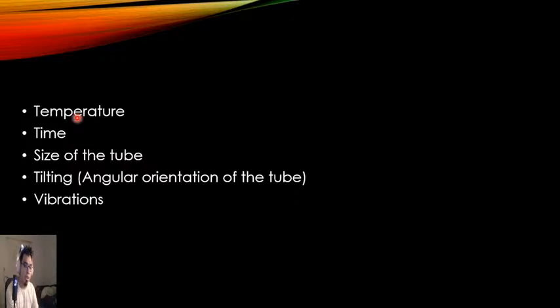Which conditions? It talked about temperature at room temp. It talked about the time at an hour, and then vibrations was put in the mix, and the question was directed towards the placement of the Westergren rack on top of the fridge.